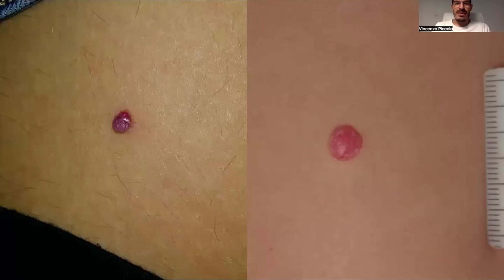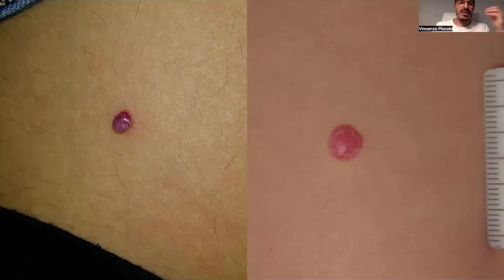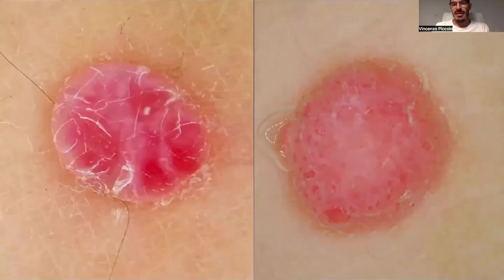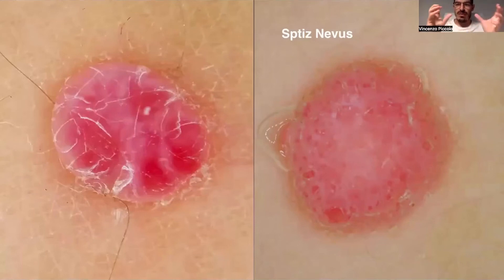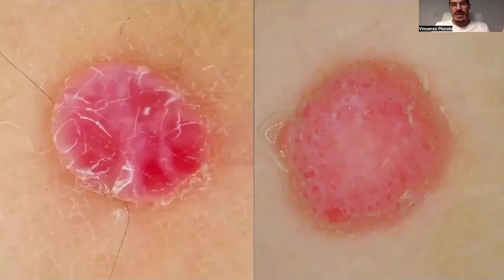Let's see a few examples together. These apparently similar lesions presenting as red nodules of the skin have two completely different dermoscopic appearances. Here we have a Spitz nevus on the right with dotted or glomerular vessels and reticular depigmentation, and on the left a pyogenic granuloma.